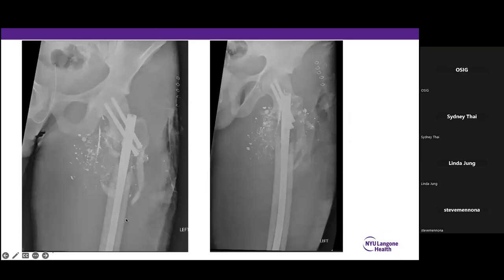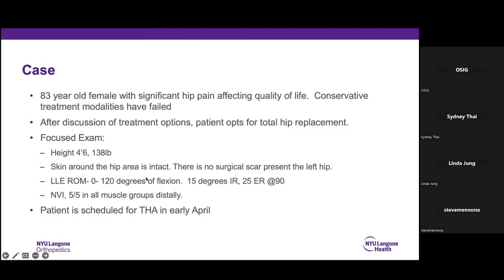And you can see here that it lines up, and aside from this bone that's missing, it looks like a femur again. And then vascular surgery went in, and they did a femoral artery repair and bypass, which is kind of cool, but saved this guy's life. Whether or not he was doing the right thing beforehand, that's a different story. But you can see the incision was all the way over here. So we did something called a fasciotomy on him. So that's cool case number one.